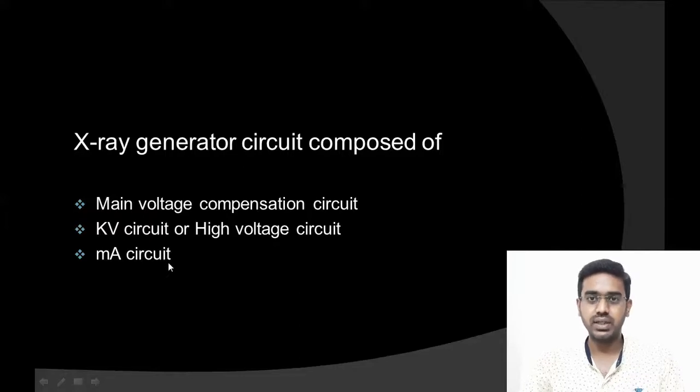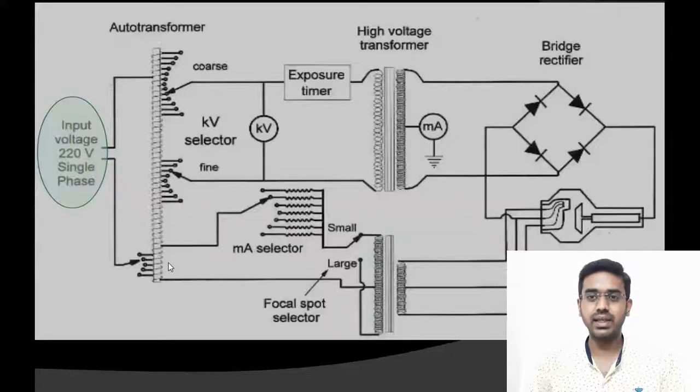A small note here, some authors have described the circuit with different headings like primary and secondary circuit, or high voltage and low voltage circuit, but please don't worry about the headings, the components are all the same.